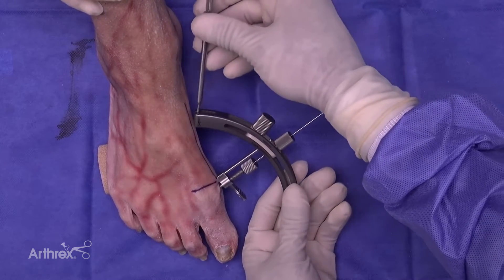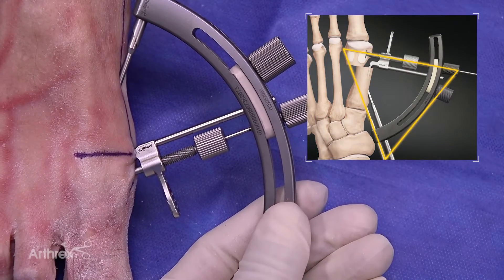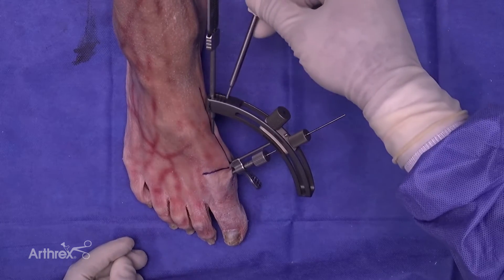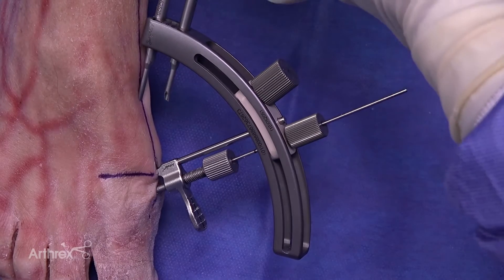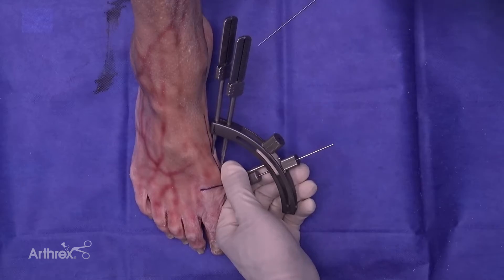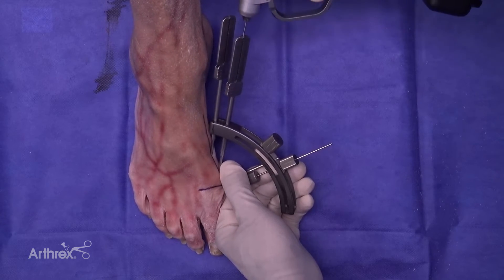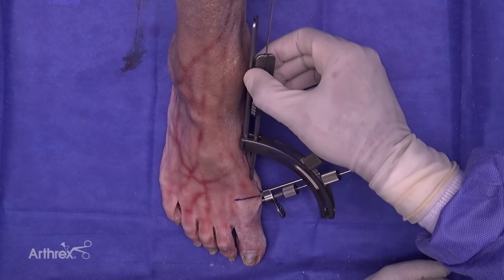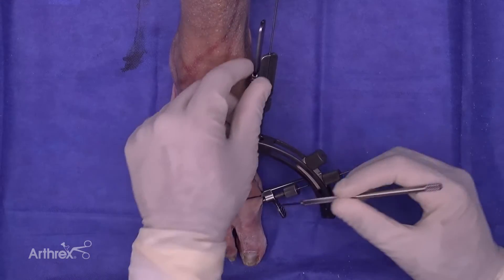Next, one of the sleeves is inserted to the most proximal entry point to confirm triangulation of our guide wires. Once you're satisfied with the position of the guide, an important step is to utilize the distal most hole to place a temporary guide wire to secure the guide to the foot. The key thing to make sure with this wire is that you remain on your midline drawing when placing it. This is the temporary guide wire going through the distal cannulation to stabilize the jig. When placing the cannulated sleeve, it is important that the bevel is in direct contact with the metatarsal prior to placement of the wire.